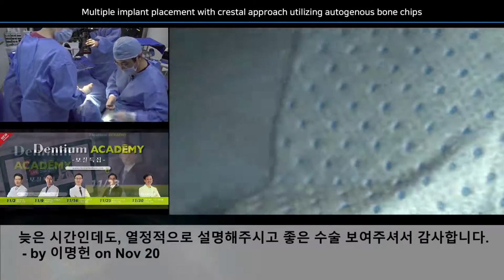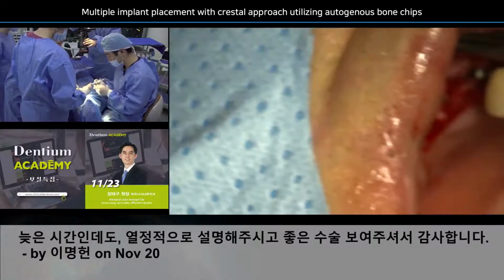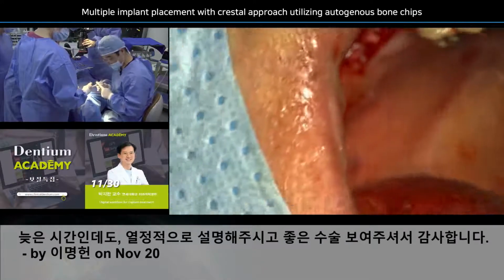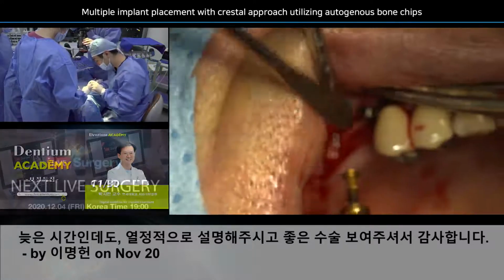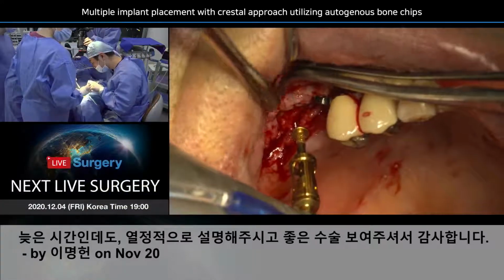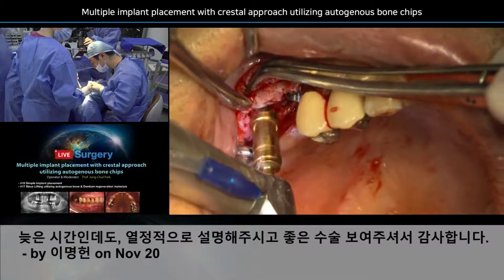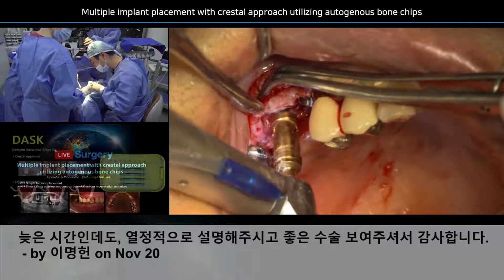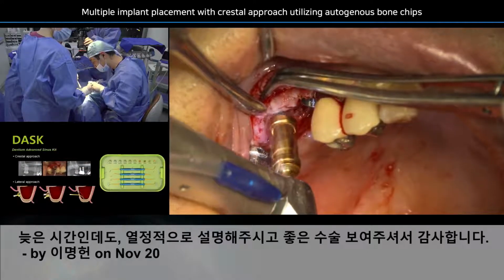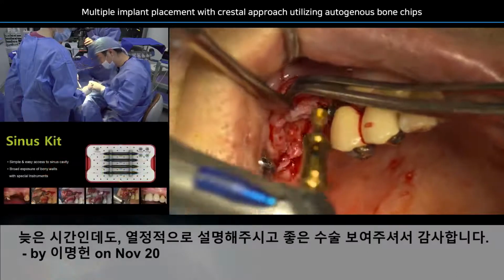So I get the information at the 10 millimeter, there was a penetration, and I'm using this tool for the 10 millimeter penetration. And I'm clearing out the residual cortical bone. So do you see the movement that I do? Yes. I'm trimming around the bone. Very good.